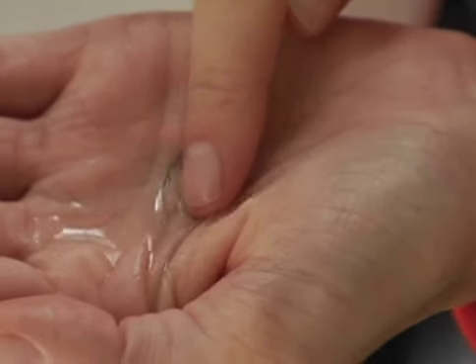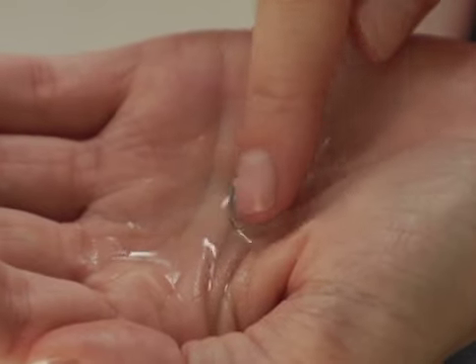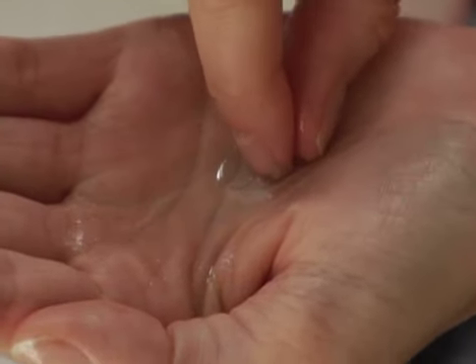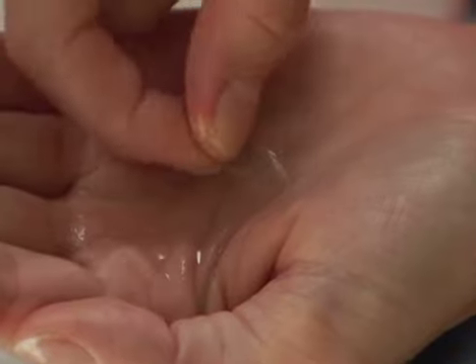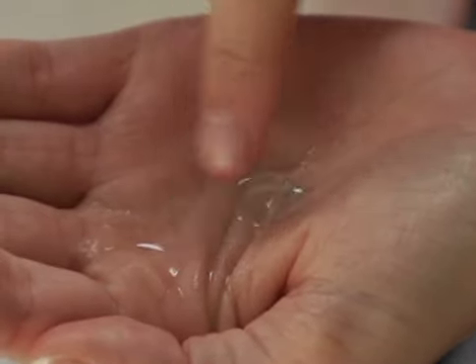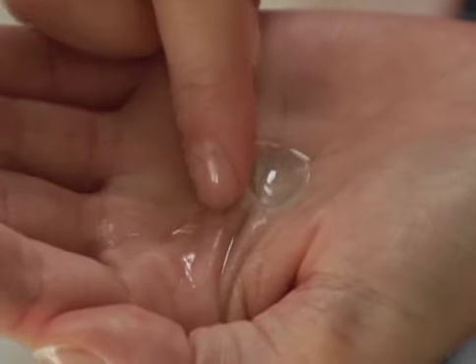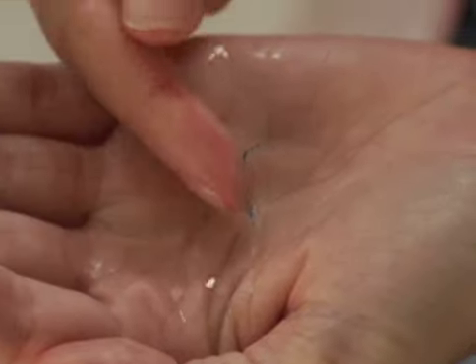Using your index finger, gently rub the lens solution into the contact lens for about 30 seconds to remove any debris, dirt and protein. You should rub the solution in gently back and forth, and not in circles. Once you have cleaned one side of the lens, turn it over and clean the other side. Don't forget to turn it right side up before continuing.